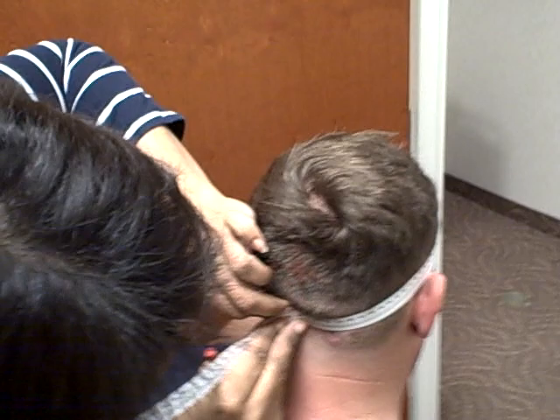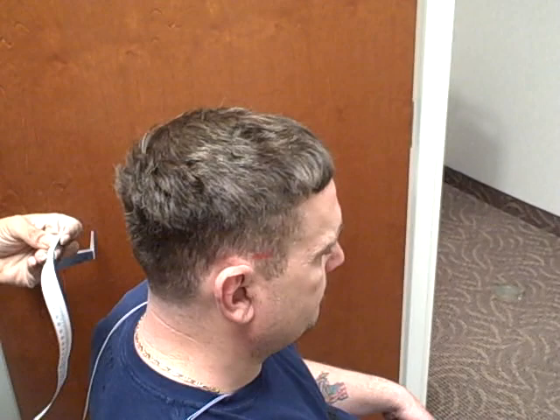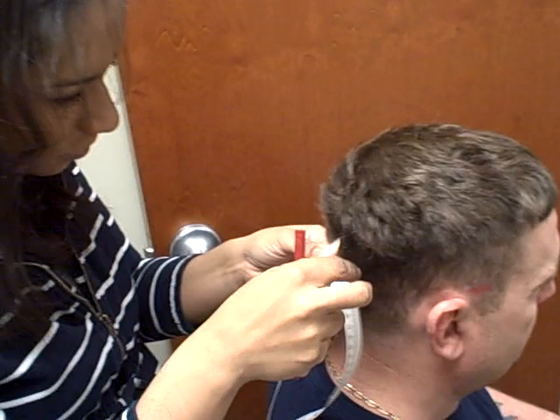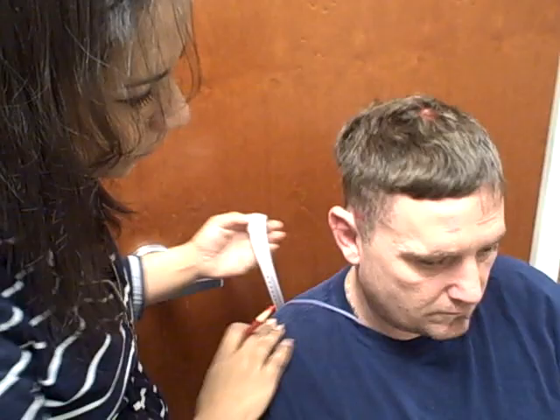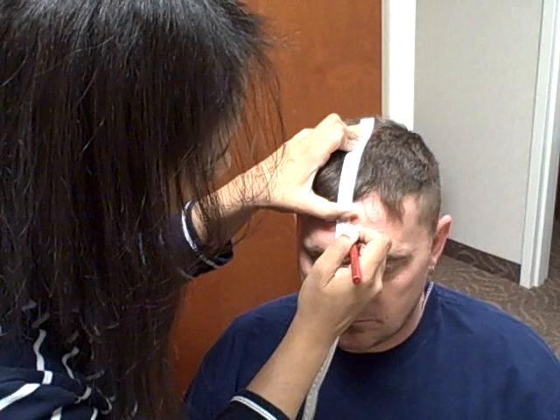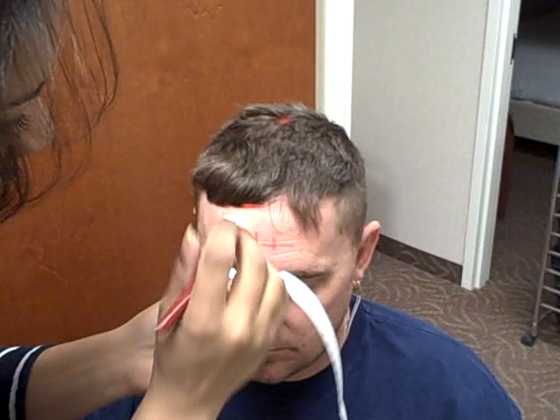The head circumference is 62 centimeters around. I'm going to take 5% of that off of my center mark to mark for the O electrodes, and I'm going to do the same in the front. I'll extend that CZ line straight down the middle and take that same 5% on each side, making my markings down the front.